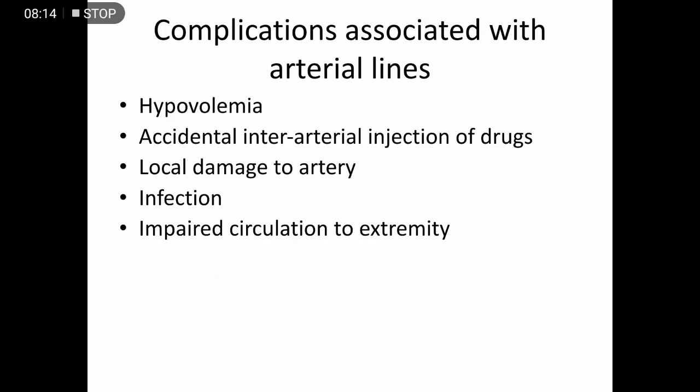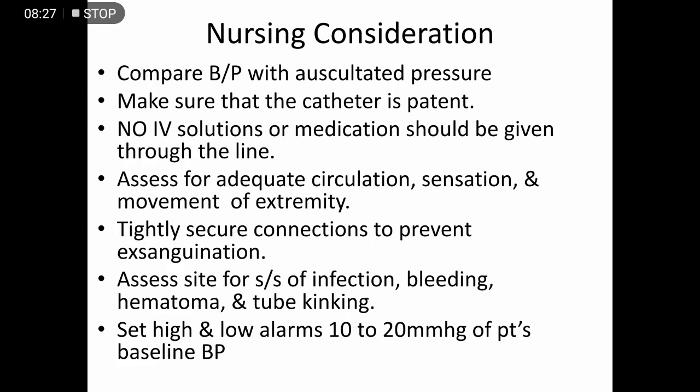Complications associated with an arterial line: hypovolemia, accidental intra-arterial injection of drugs, local damage to the artery, infection, impaired circulation to the extremity.